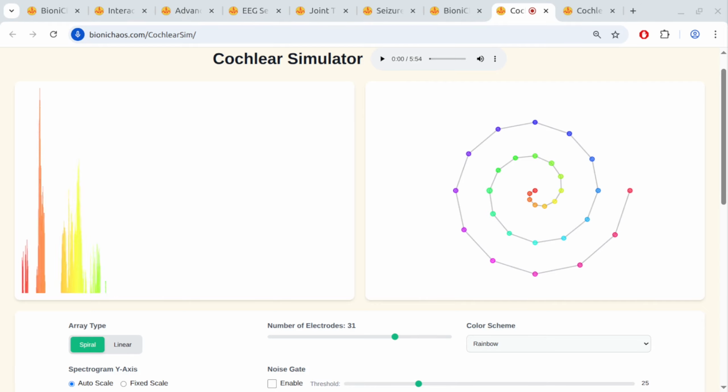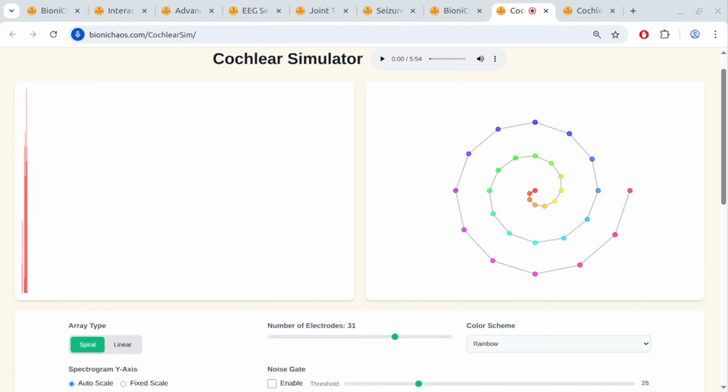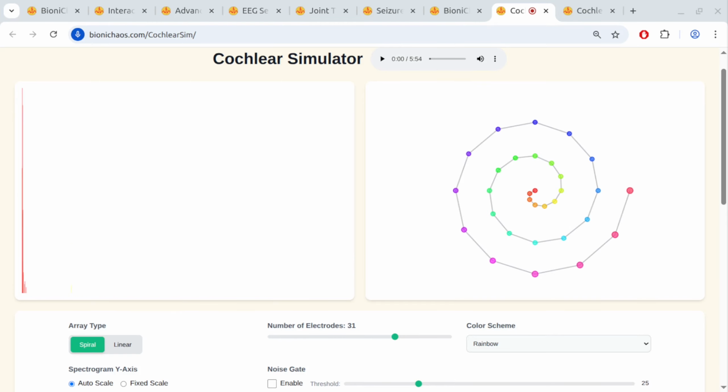Based on the spectrogram alone, it's challenging to determine the exact words you are saying. Spectrograms represent frequency distribution of sounds over time, which can show the phonetic structure of speech, but they don't provide the specific words themselves. It would be difficult to accurately transcribe your speech without additional information or context.